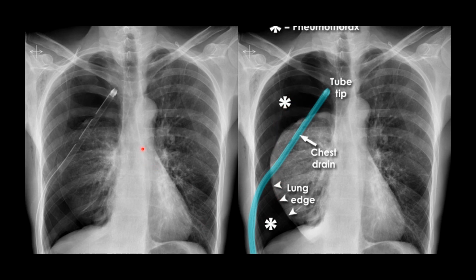It's really fascinating to look at chest tube placements before and after, when you look at a pneumo, put a chest tube in, and then look at the post chest tube placement.